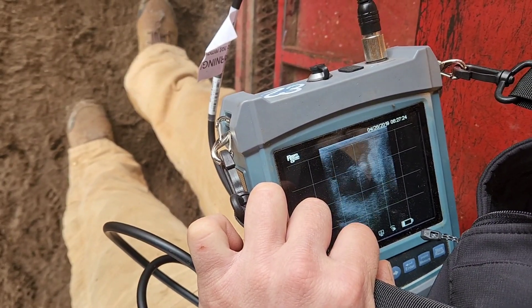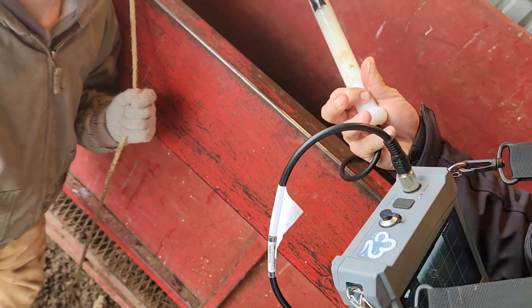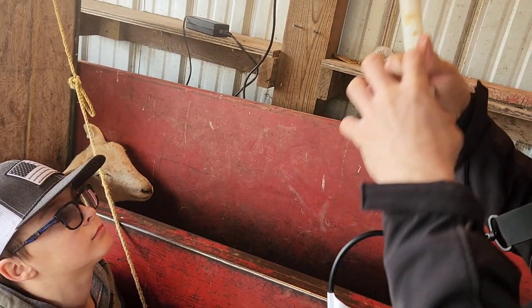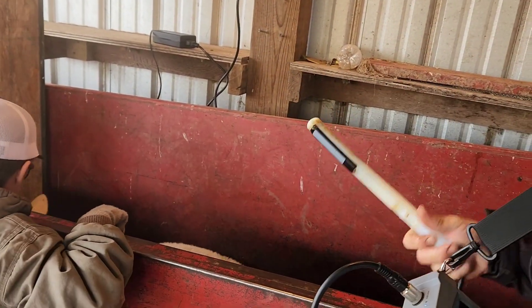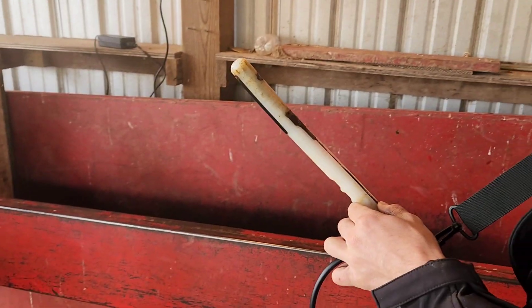So do you think it's just a single? It's hard to tell because if you had a twin, he could be right underneath him. With this ultrasound we're only getting to look at a limited area, and in the other horn he could be slung down a little farther and we're not seeing it. But this way we can officially tell bred from open.